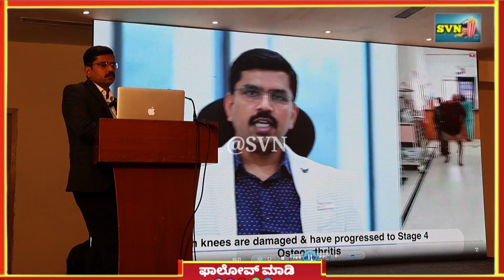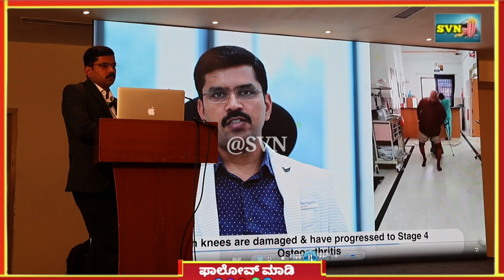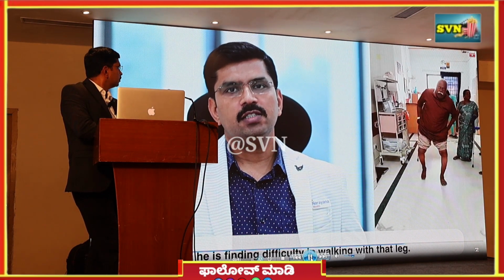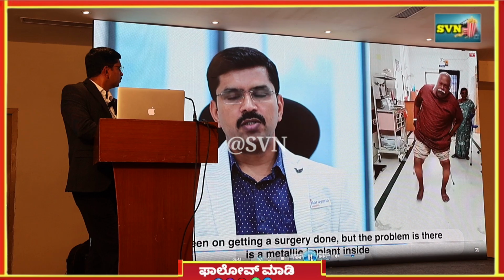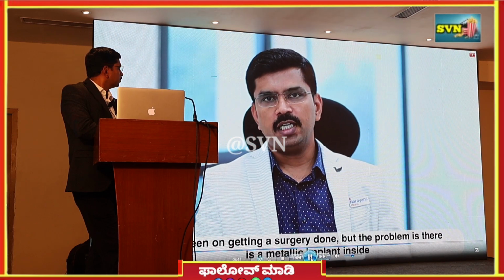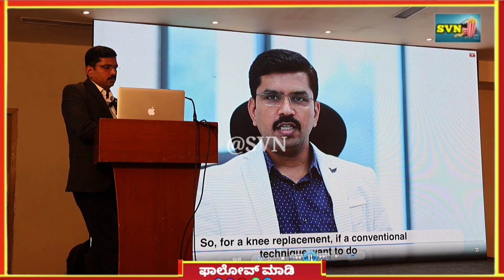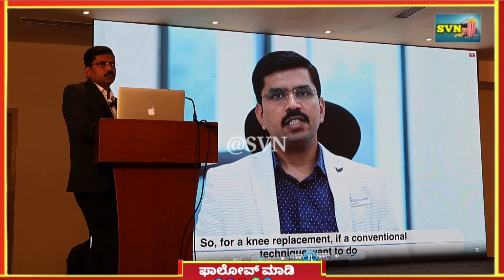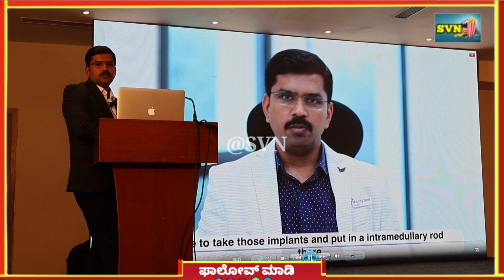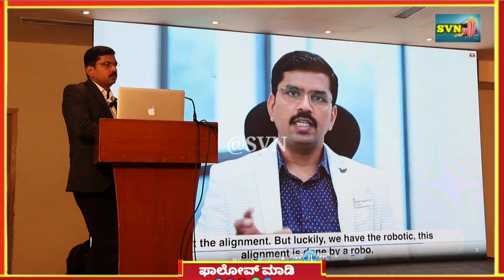His both knees are damaged. They have progressed to stage 4 osteoarthritis, where both his legs are in varus. He is finding it difficult to walk. So he is keen on getting a surgery done, but the problem is there is a metallic implant inside. For knee replacement in a conventional technique, we would have to take those implants out so that we can put an intramedullary rod there to get the alignment.